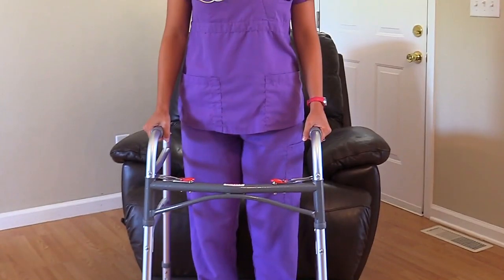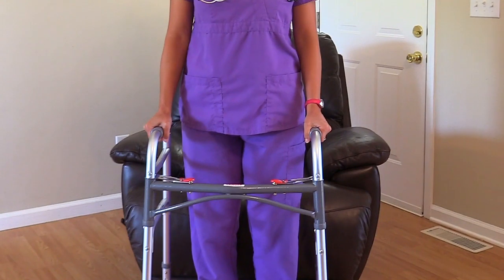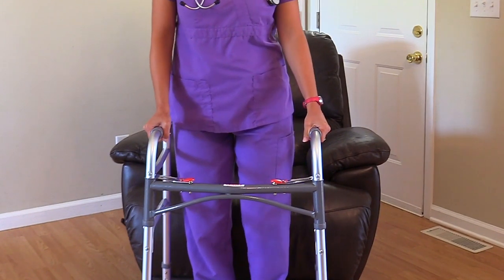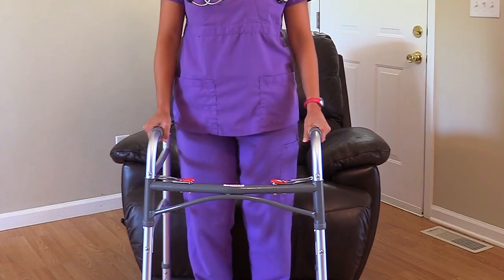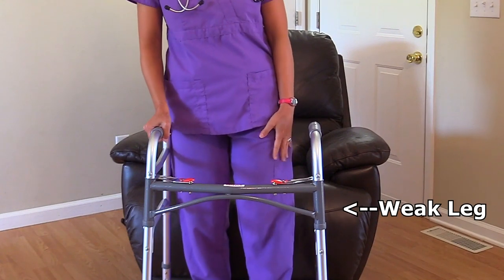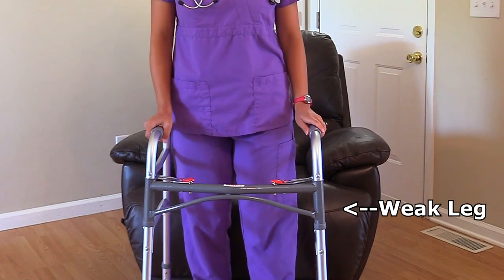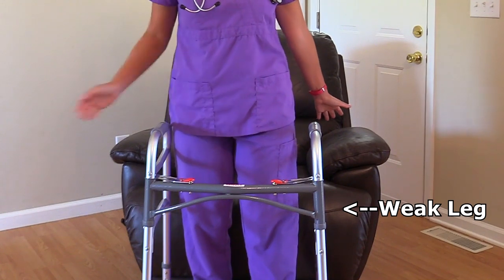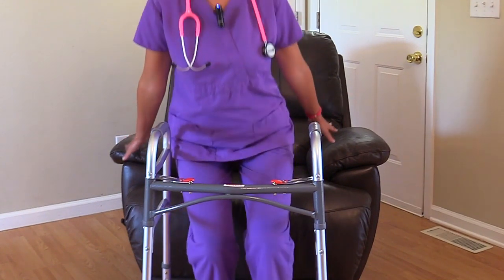To sit down in a chair, a patient is going to take their walker, hold on to the hand grips, and slowly back up to the chair until they feel the chair with the back of their legs. Then they're going to slightly extend that weak leg out and take their hands and position them behind them, bend their strong leg, feel for the chair's armrest, and then sit down.